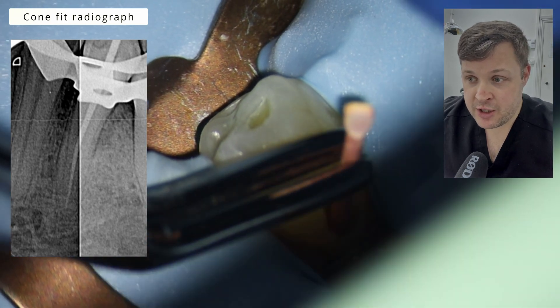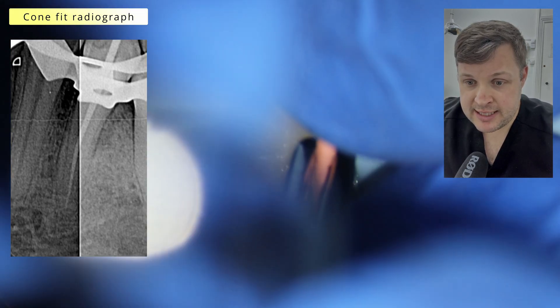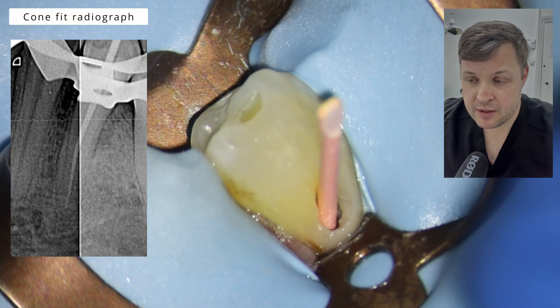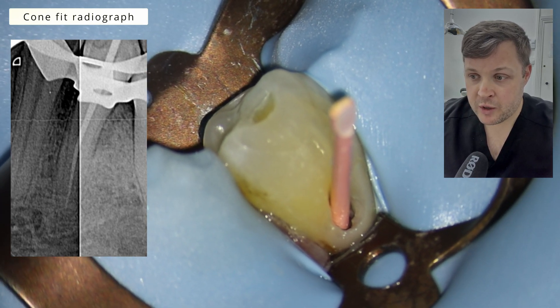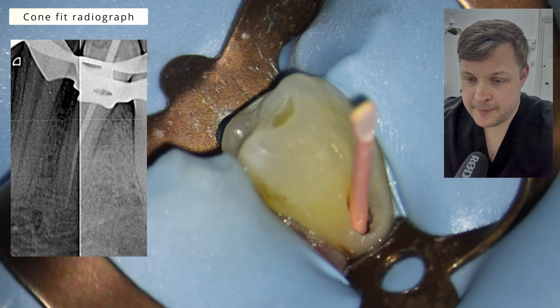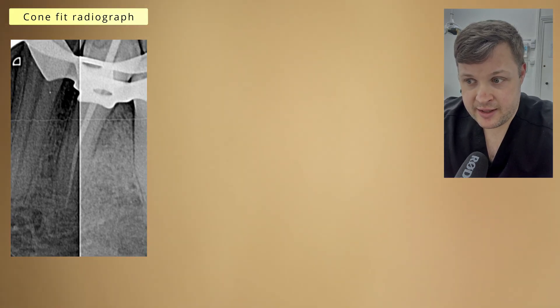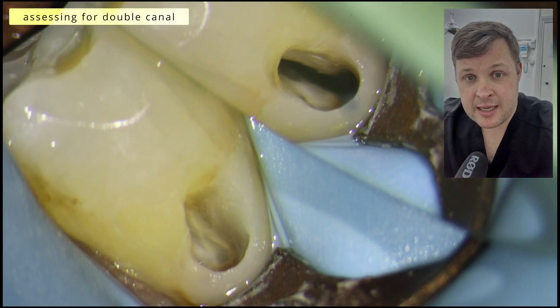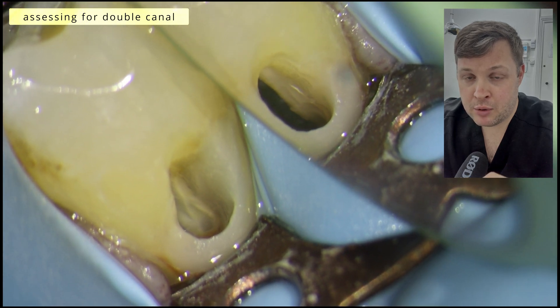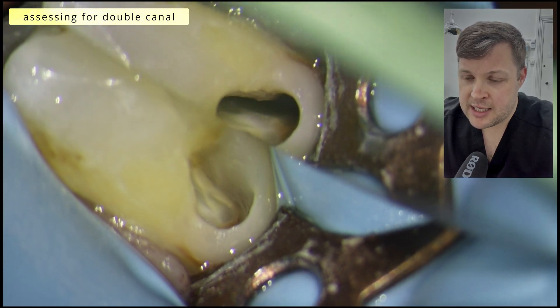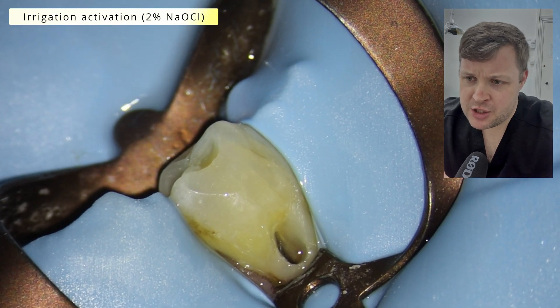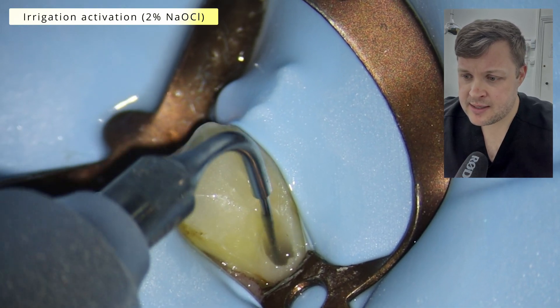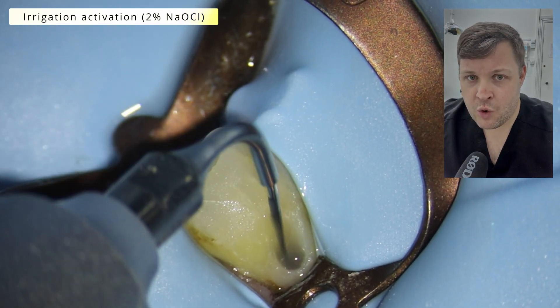Cone fit radiograph — we're using a matched cone and deliberately a lower-tapered file because of the calcified nature. I also don't want to create too much weakness in the coronal portion of the tooth, because a higher-tapered file would remove a lot of the dentin. There was a possible suggestion of a double canal, but I had a look inside the access cavity and was happy that there wasn't one.